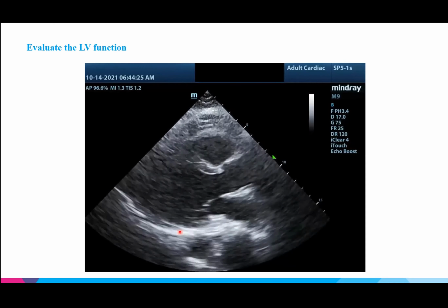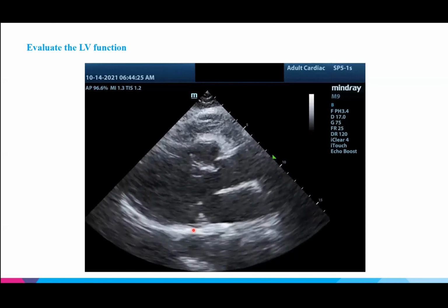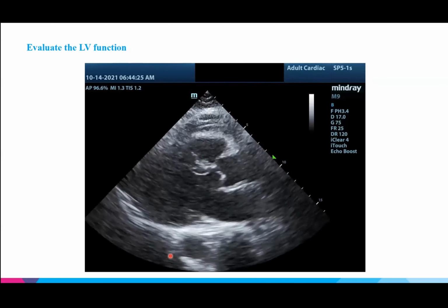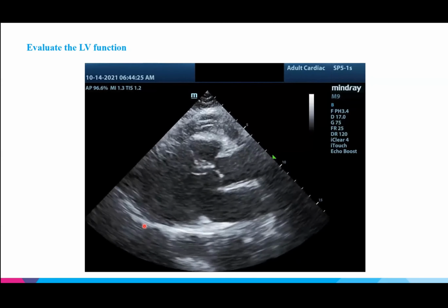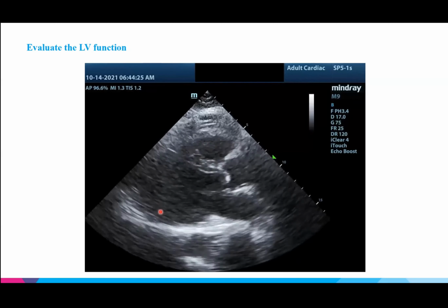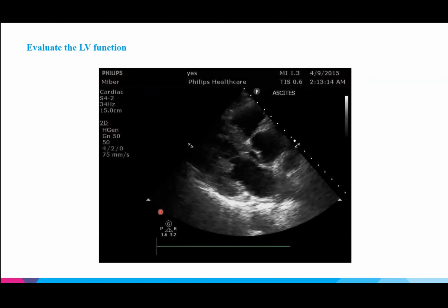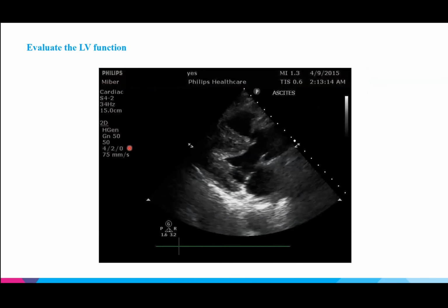If we are seeing fluid above it, then that would be indicative of pericardial effusion. If we were seeing fluid sort of to the side or below, that would be a pleural effusion, which we're not seeing either in this case. So we have just a couple more clips.